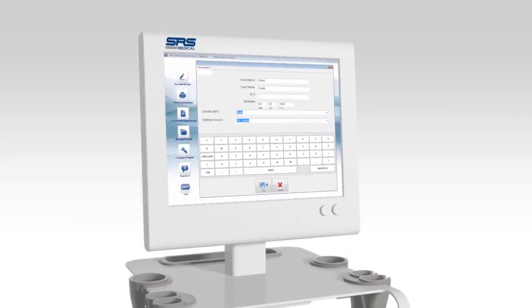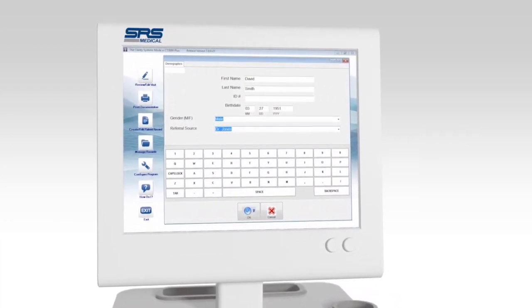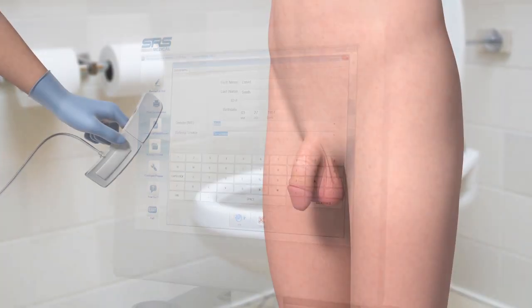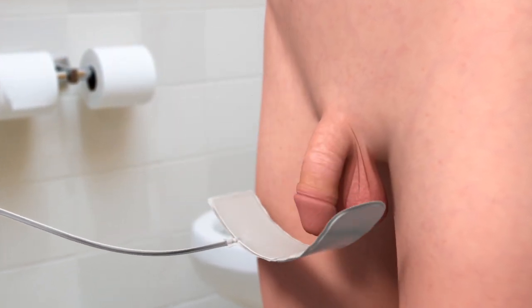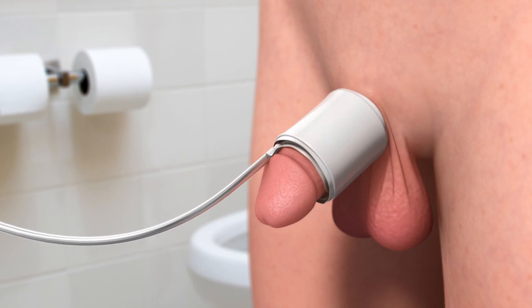Basic patient demographics are entered into the system to store the patient's results for future reference and for comparison to follow-up UroCuff tests. Before beginning the test, a small pneumatic cuff — similar to a blood pressure cuff — is wrapped around the penis. The cuff should be placed closest to the body and wrapped snugly, again similar to a blood pressure cuff.